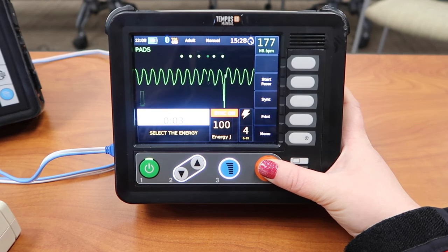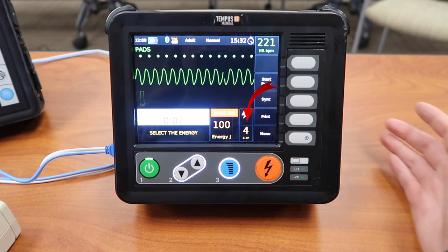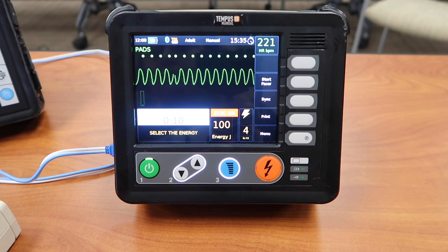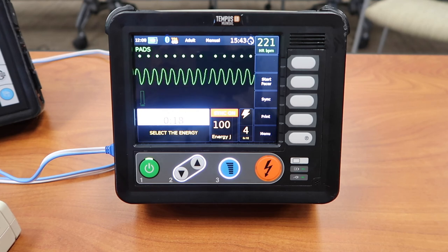And it's kind of cool on the Tempus, it keeps track of how many times you've shocked. So right there, you can see that was the fourth shock delivered. And as you can see, even after you deliver the shock, it goes right back into sync mode and the energy is still the same. So it allows you to increase if, let's say, you didn't get conversion, you want to try again.